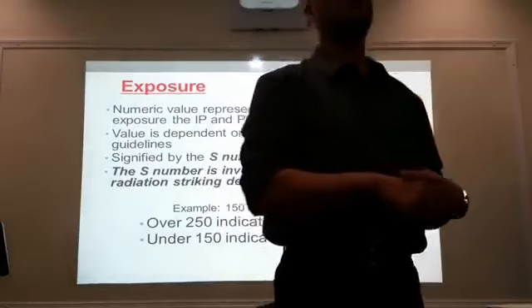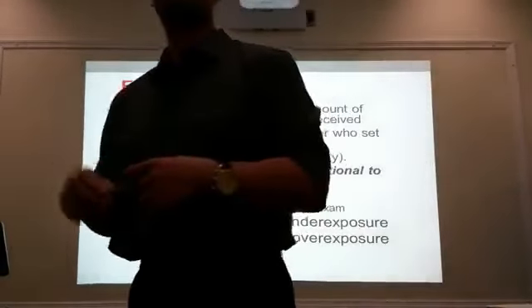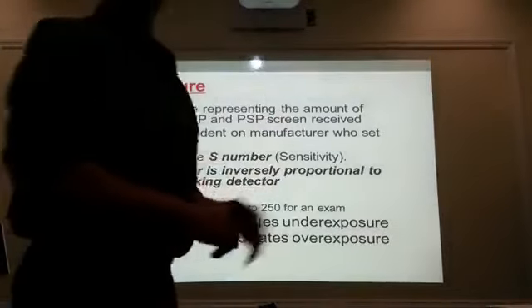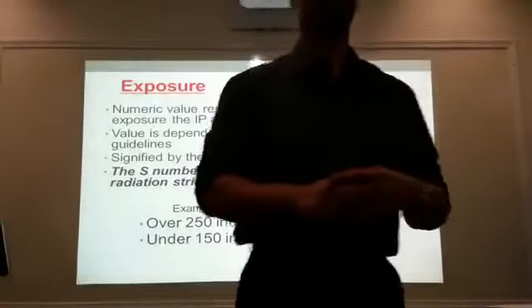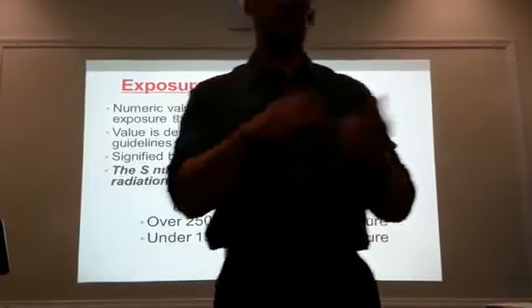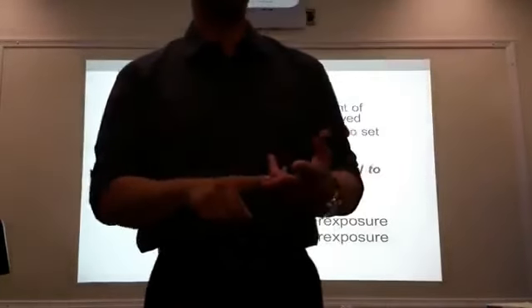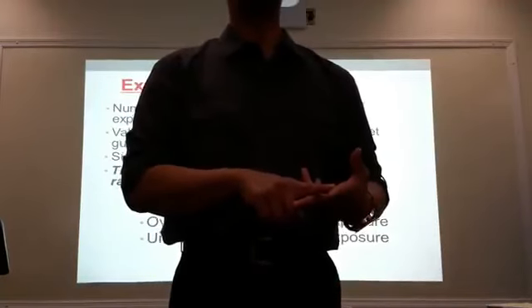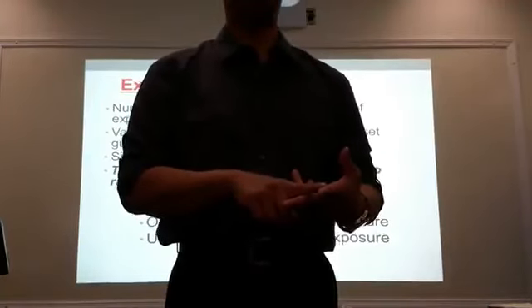With computerized radiography, it doesn't matter what technical factors you use because the algorithm and the software program corrects it for you every time. So no matter what you do, if you choose the wrong kV and the wrong mAs, or a combination of both, your image is going to come out sweet.